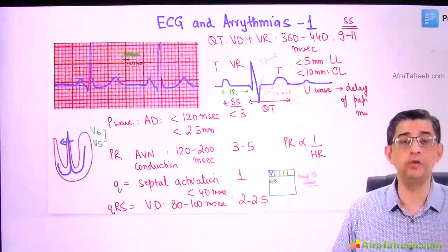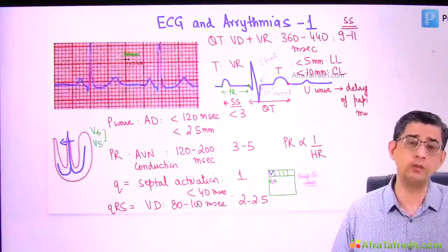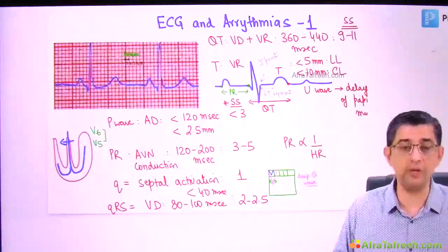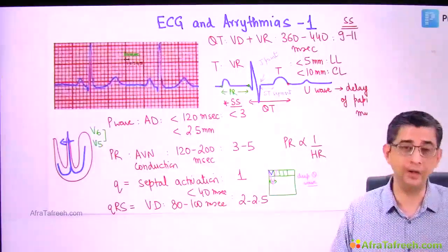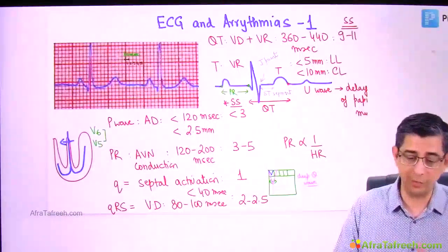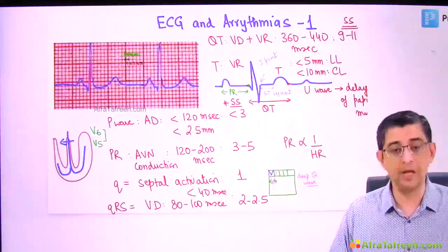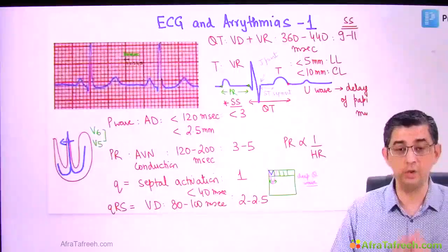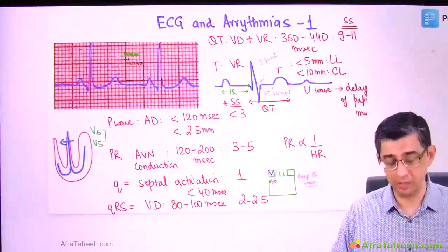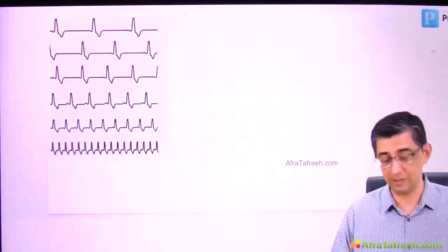When you regularly do 4-5 questions of ECG daily, then after 10 days, see your approach. Don't try to do all of them in one day. I mean, if you're trying to do 50 questions of ECG in one day, thinking 'I'll finish it today,' then the point is it will lead to frustration. So spread it out. This topic should definitely be spread out, especially when it comes to doing questions. And in the first 5 seconds, guys, whenever you are analyzing an ECG, you have to check the heart rate. So next, I'm going to focus on how you analyze the heart rate of the ECG.